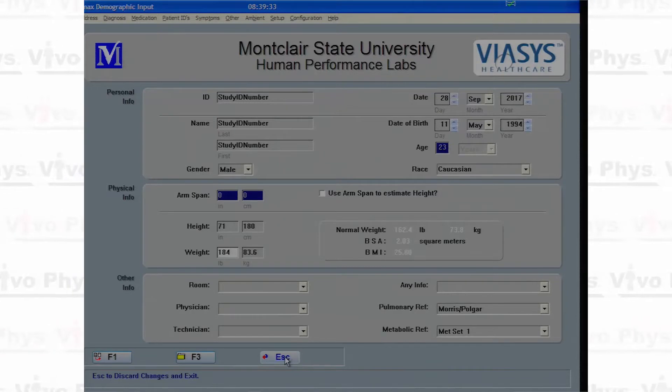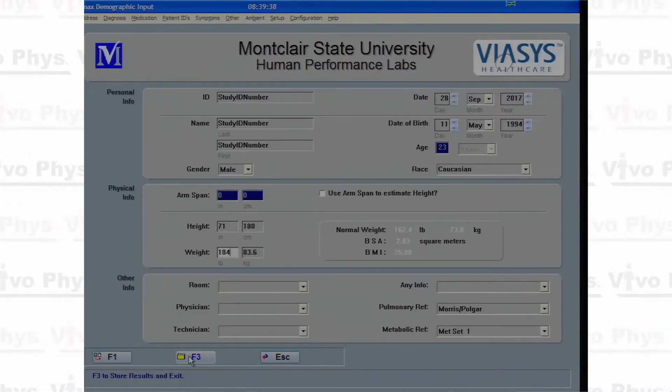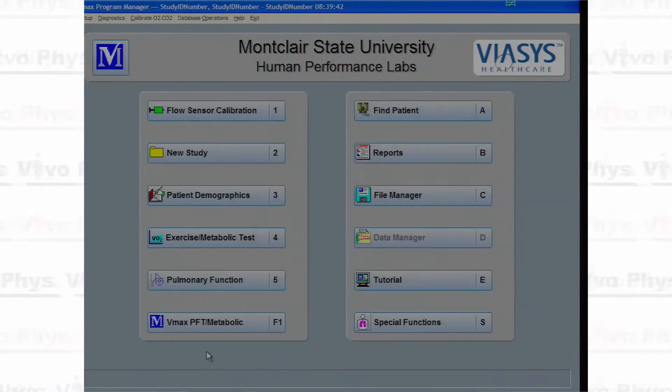In this software, when you're trying to store whatever's in the current dialog, hover the mouse across the bottom of the screen where those buttons are, and it will tell you what those buttons do. Make sure that you click the one that says store and exit, and that will get you into the screen where you can go into the exercise test.